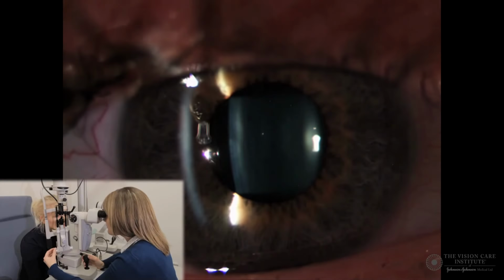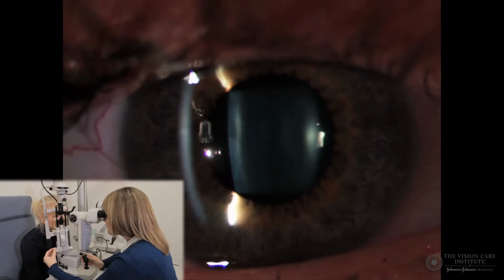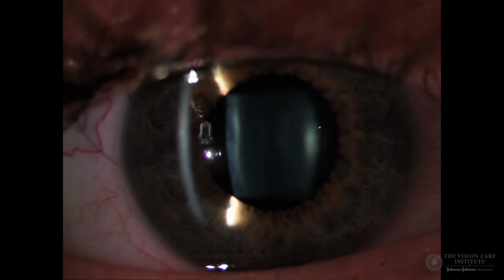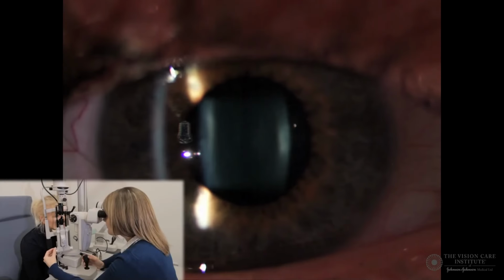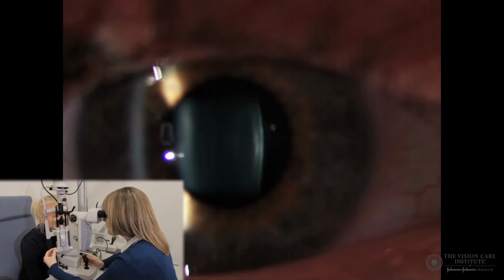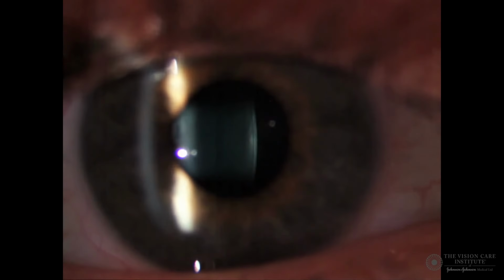Moving the slit lamp forward further still, we allow the nucleus of the lens to be focused. We can see here that in this young patient this is nice and clear, as it is optically empty and appears black. We can push the slit lamp further forward again to see the posterior parts of the lens, and we can see that these are coming into focus here.